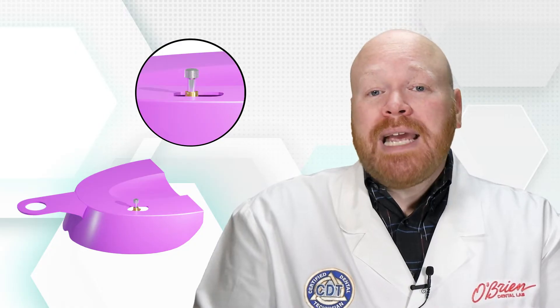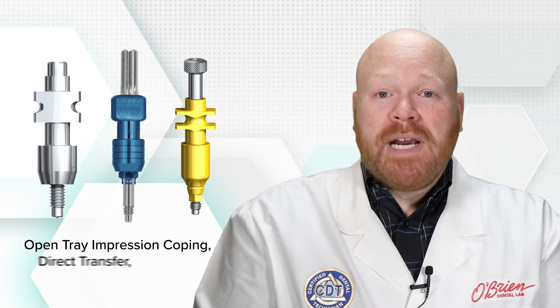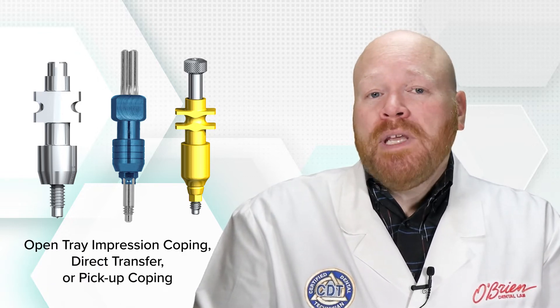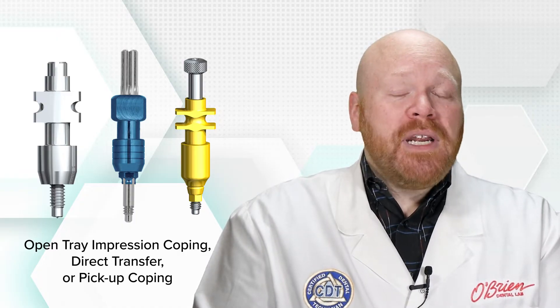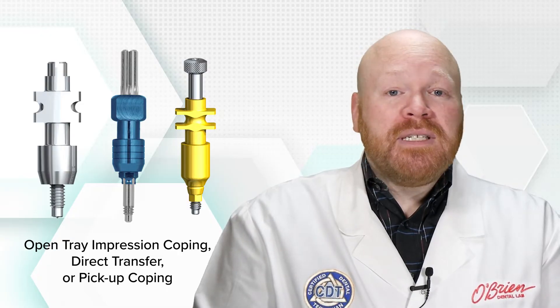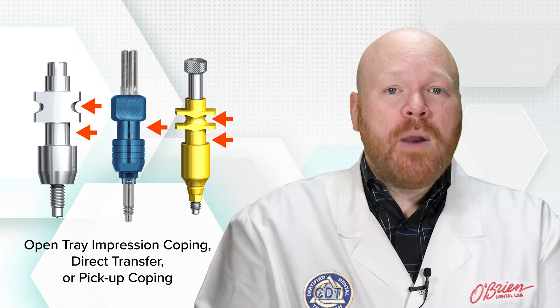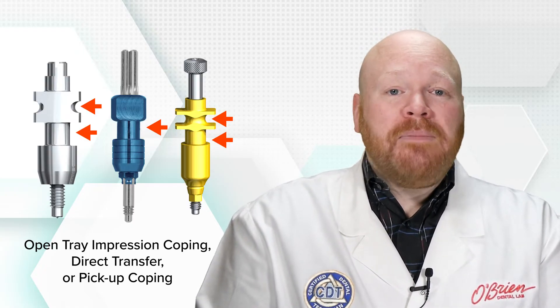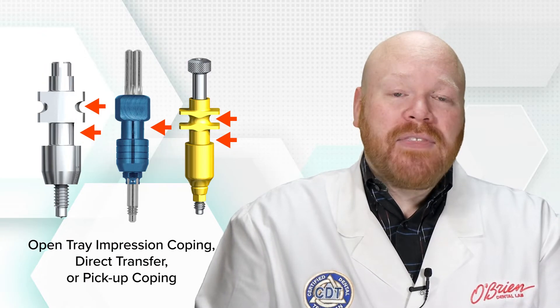In order to take the impression, you will need an open tray impression coping, which is also known as a direct transfer or pickup coping. It's important that you only use an impression coping designed for open tray technique to avoid an inaccurate impression. Open tray impression copings are designed with heavy retention elements that prevent them from being removed from the tray once the impression material is set up. They have hard edges and deep features that provide retention and allow the impression material to lock them into place.